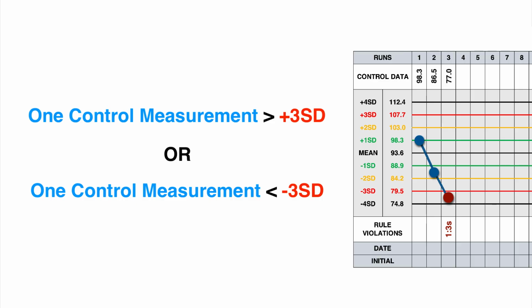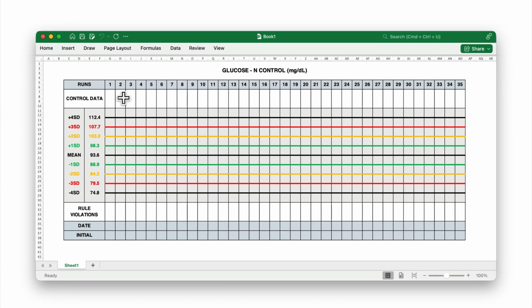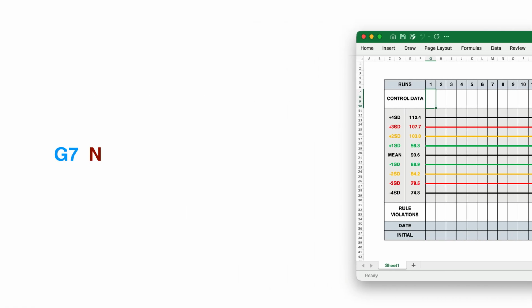The very first step is making sure the cell we're testing isn't blank. For example, if we're starting with cell G7, we don't want Excel to try and evaluate an empty cell. That could cause problems. So we write G7 not equal to empty. Think of this like a filter. If the cell has no value, Excel will stop right there.